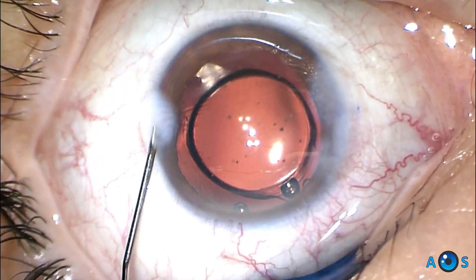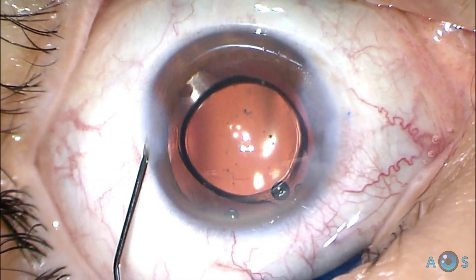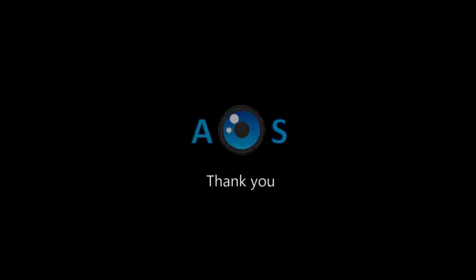The corneal incisions are hydrated, and this refractive surprise case is now resolved using this classical and efficient surgical technique.